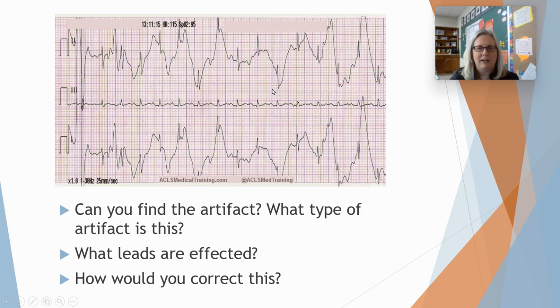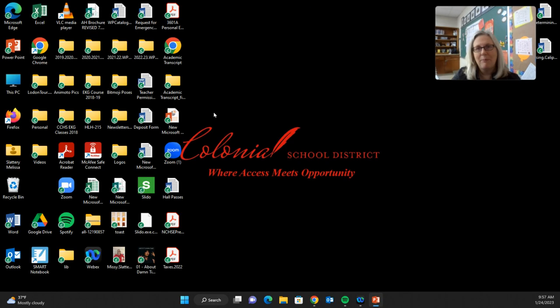These are almost always sticker related. So just go back and make sure your stickers are nice and flat. You have it clipped on there properly, and everything's laying nice and flat, and the patient's laying nice and still. So this is a form of muscular artifact. All right. I think we just wrapped that up.